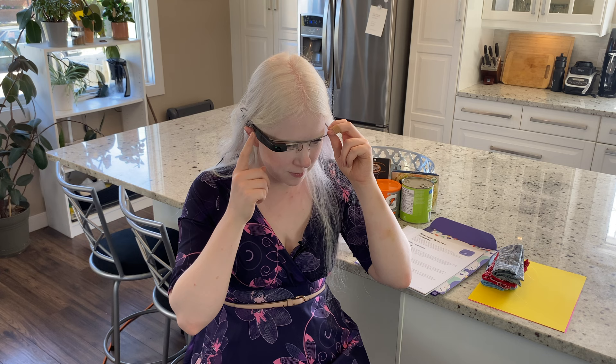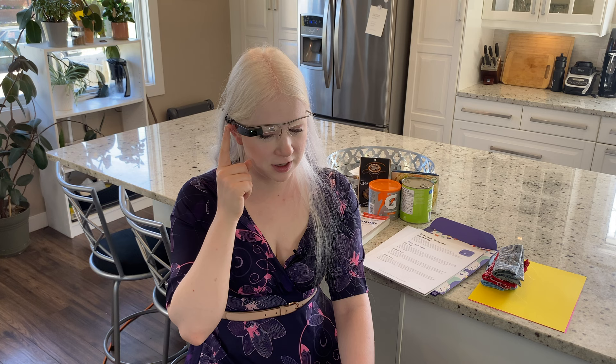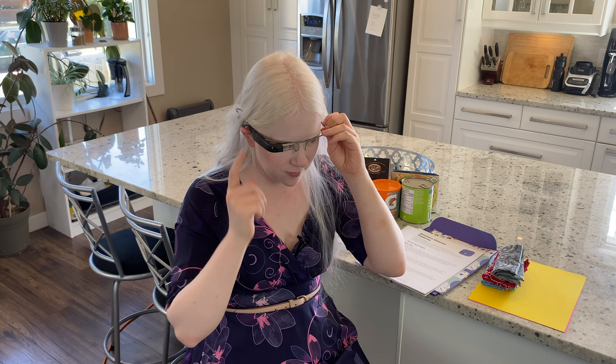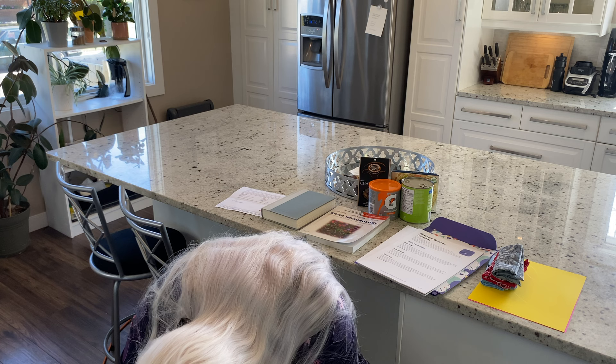Under Find Object we have lots of different options: bicycle, bottle, car, cat, chair, dog, keyboard, laptop, motorbike, sofa, table, toilet, traffic light, train. We're going to identify a chair — it dings every time it sees a chair. No chairs over here, but if I turn around there should be some chairs — it found it. We're going to see if it can find Patience — my cat. It found her: 'It's a Patience! Ding ding ding! It sees Patience!'